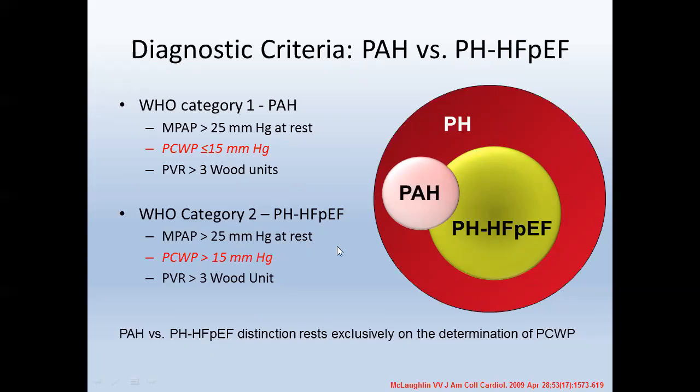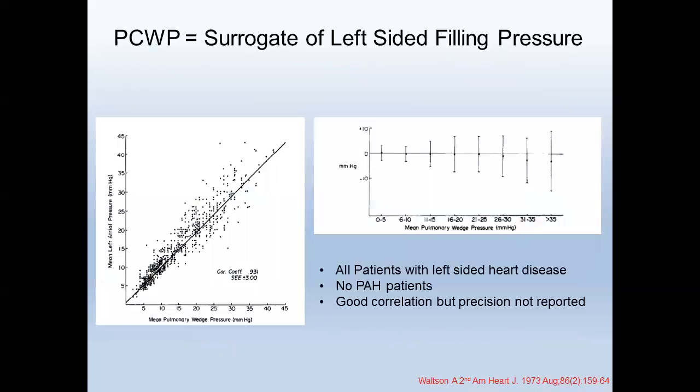And if it were just classification, that would be okay. But the prognosis changes, the treatment changes, completely everything changes. So take extra precautions to do that. And as I said, wedge pressure is good, but there can be some problems.